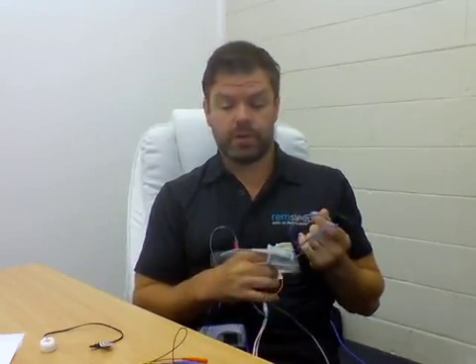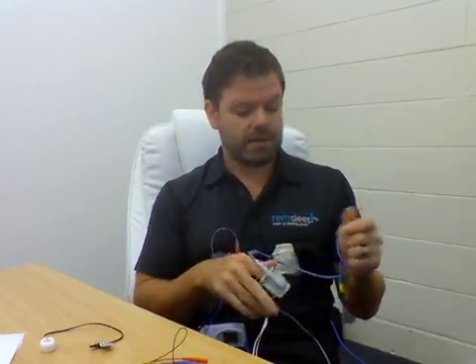Once you've completed all those steps, you don't have to press any buttons. The machine will turn on automatically, and it will turn off automatically. The recorder's already programmed up, so you just have to put the bits and pieces on. It will turn on by itself, turn off by itself, and then we will see how you've gone, and I will normally give people a call and let them know how their results are.